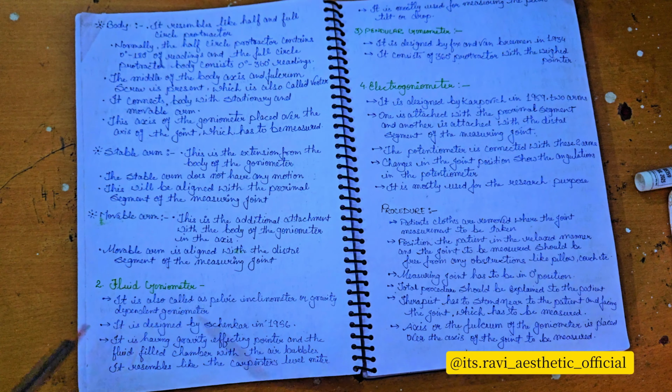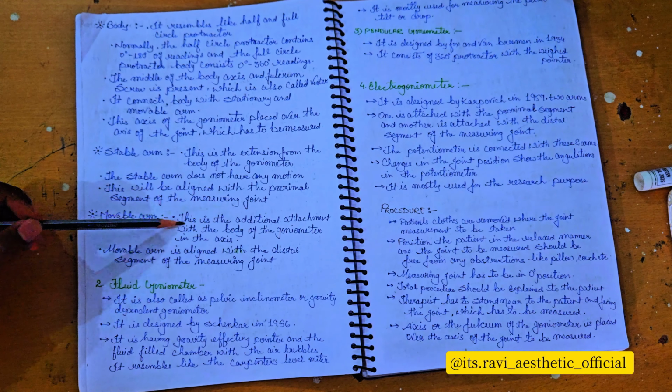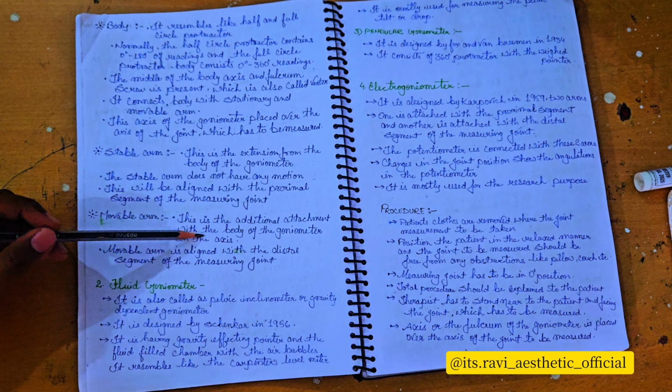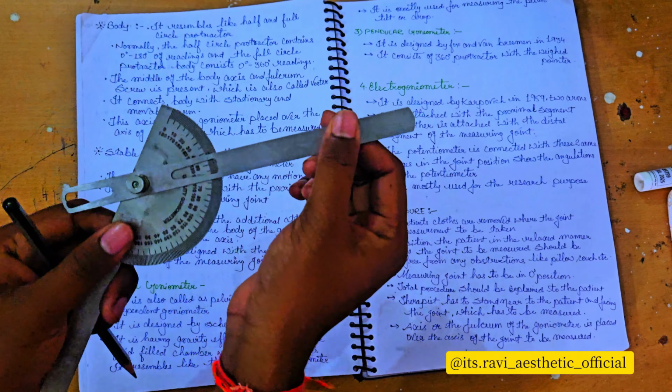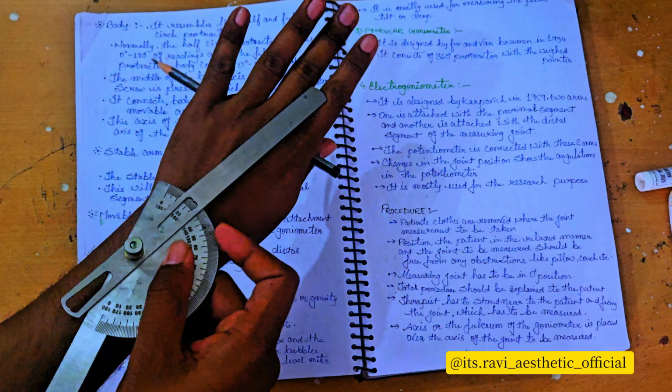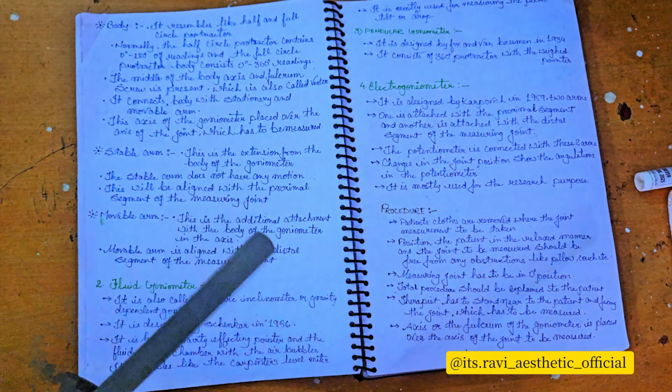So here you can see written here. The movable arm is the additional attachment of the body, the goniometer of the axis. The movable arm is aligned with the distal segment of the measuring joint. So here it is a movable arm, the distal part of the joint, so we can measure the ulnar deviation and radial deviation of the joint.